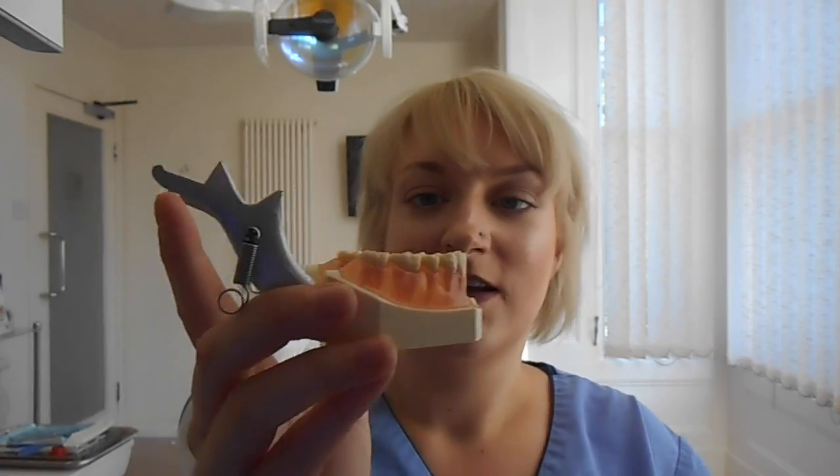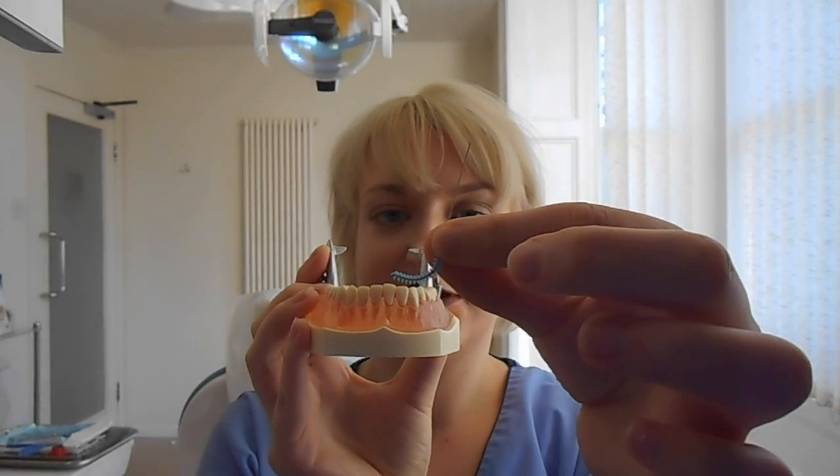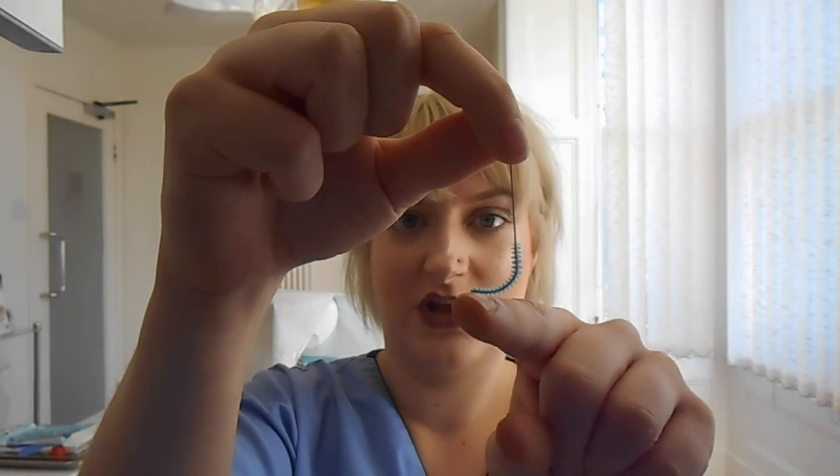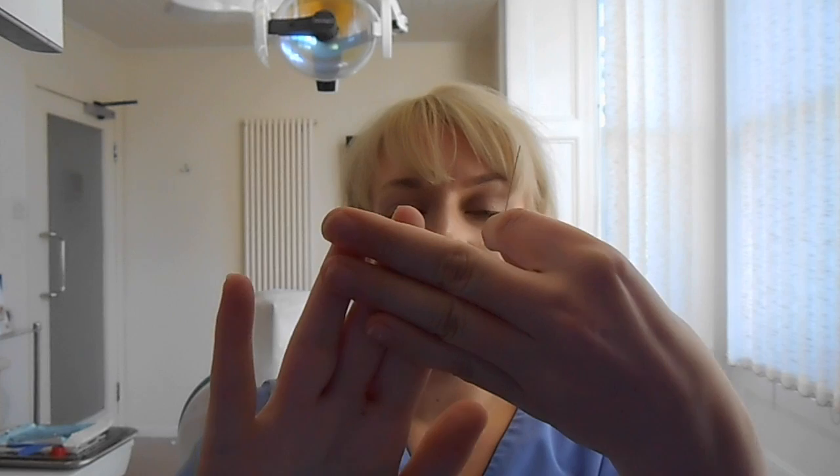So I'm going to show you basically on the model first how to use them. This is a lovely model of your mouth, a replica, so I'll show you how to use it. So if you are using the brush on the lower right hand side, you need to use your left hand, and you need to pop the brush this way, so it's facing downwards, the curve is facing downwards. You need to pop your thumb of your left hand in the curve, and you need to pinch together with your index finger. Okay, and these three fingers here need to be on the outside of your mouth, so you're not using these fingers to go inside your mouth to use the brush.